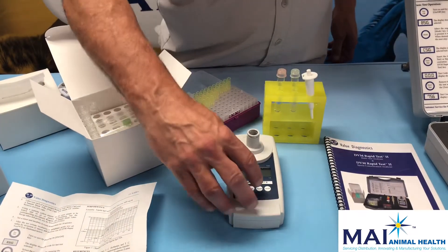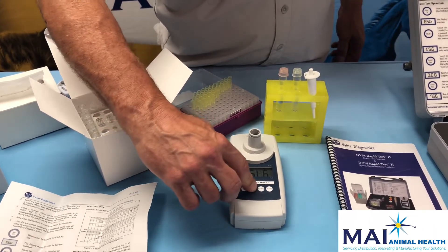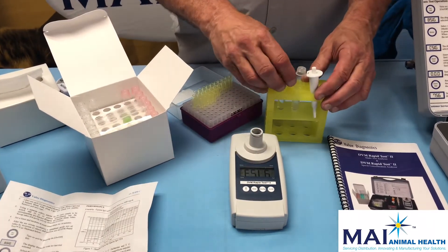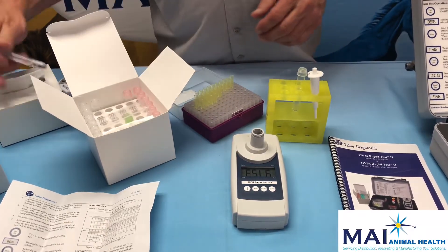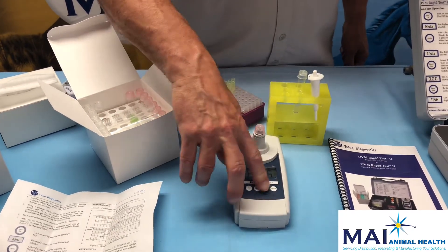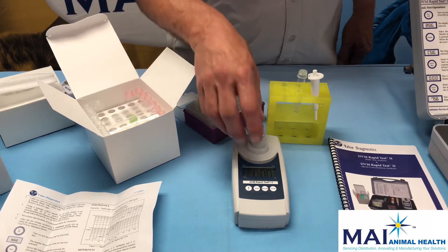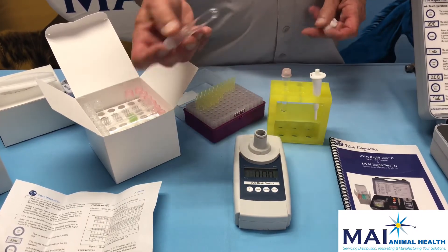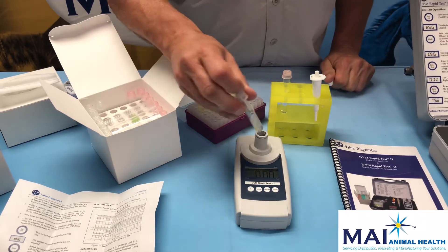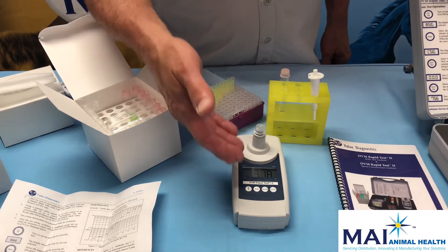After 10 minutes, turn the instrument on. Use the mode key to toggle until you reach equine serum IgG. Take the blank tube, mix it, make sure the outside is clean, place it in, and hit the zero/test key. We get our three zeros. Then mix the sample tube, make sure the outside is clean, press it in, and hit the zero/test key.